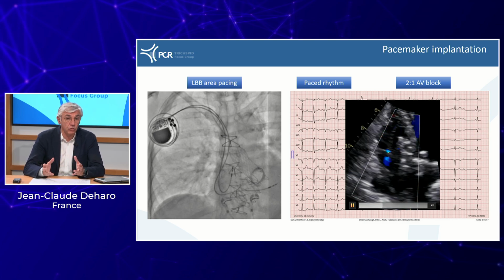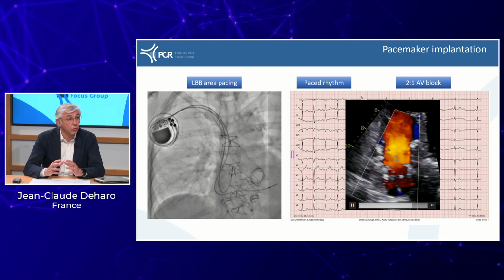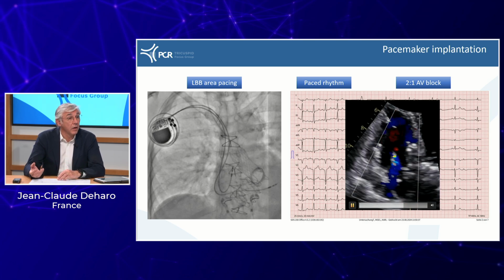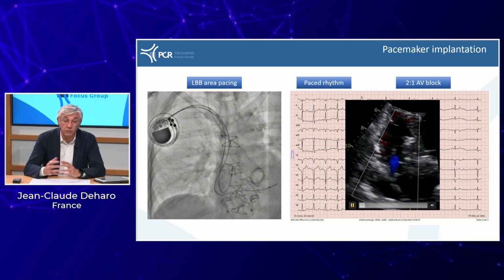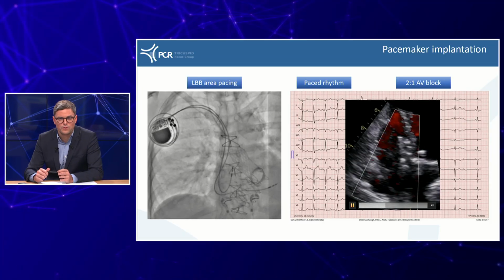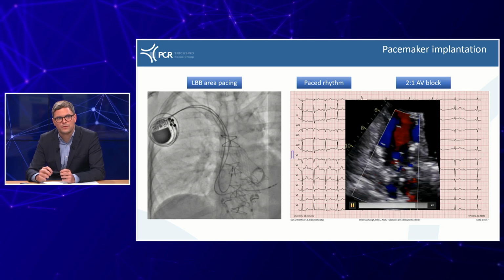So I'm sure that you had a thorough discussion, you all discussed, and the decision was taken because of the left ventricular ejection fraction decrease in this patient. Yeah, exactly. So you see here the final result, which is actually very good. But of course, we will follow this patient further to see how is the durability of the valve, how is this evolving, and learn a lot from this case.